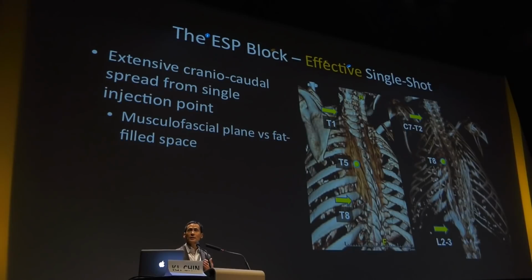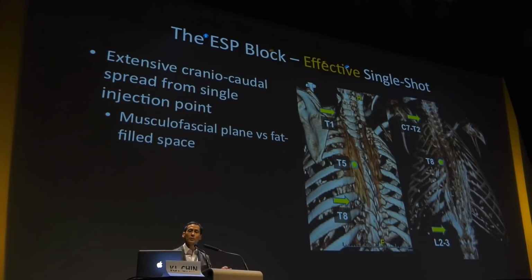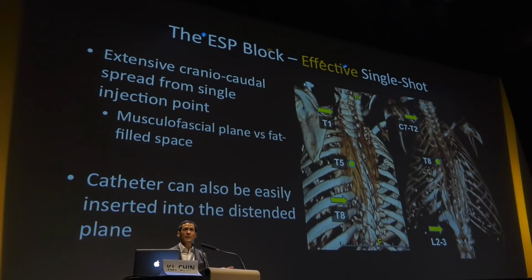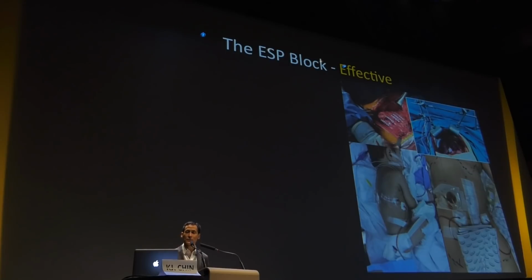Now, the second reason that I think it's a very attractive technique too is that there is really no need to do multiple injections to cover multiple levels. Because it's a fascial plane, you get this extensive cranial caudal spread going up and down, and it seems to go in both directions regardless of which way you're pointing your needle. As I've said before, also once you've opened up that space, it's very, very easy to put a catheter into the space, and you can see the catheter as well lying within that space.